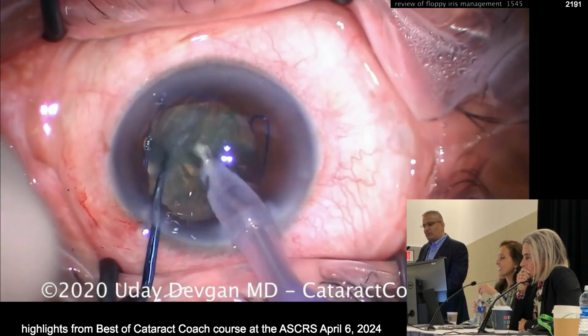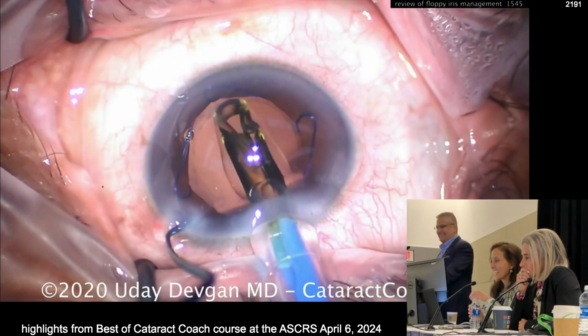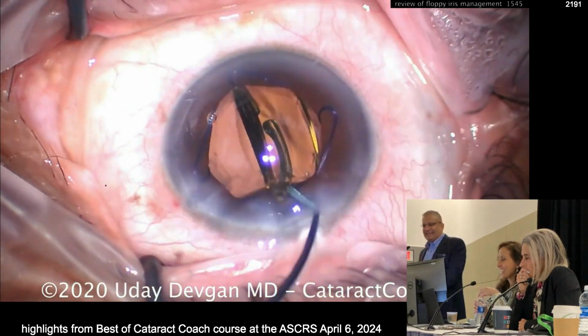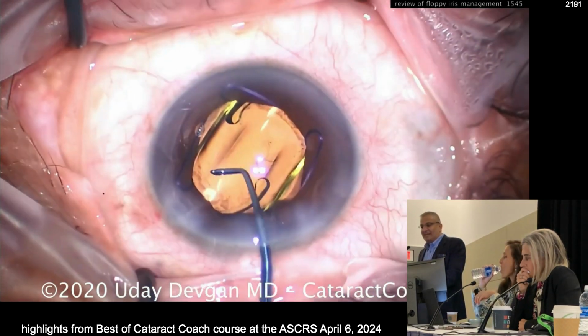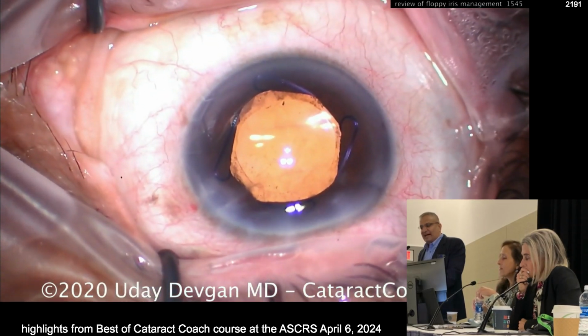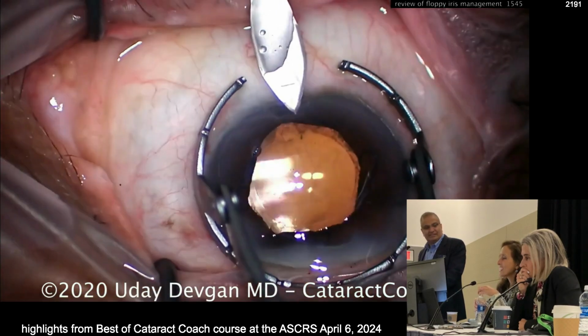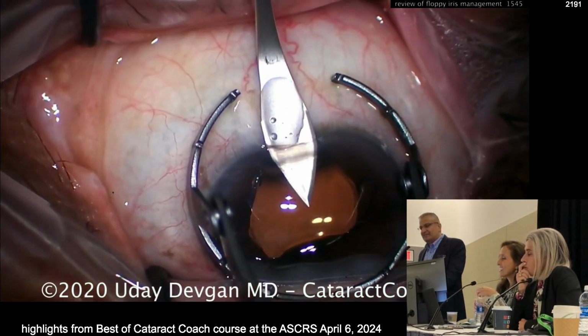Rest of the case is pretty normal. Look, chopping in the bag, in the bag. Woo! All right. And so here comes the lens going in the capsular bag, end the case. Now the eye's still full of viscoelastic. Here's how I take the ring out, and you tell me if you do it differently. I'll just disinsert it here. Oh, there's the opposite incision. We're doing paired incisions for an astigmatism treatment. Okay. Oh, wow.